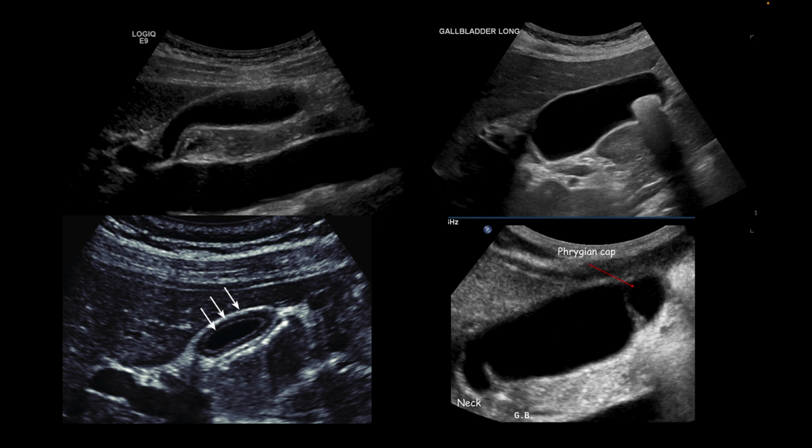Now, gallbladders can come in all different orientations and folding arrangements, and the common one that we see is a thing called a phrygian cap, which is essentially where the fundal part of the gallbladder is folded over on itself, so you get this little bend in the fundal end, and this is a normal variant, though it can look like an internal abnormality to the uninitiated, so just look at it in a couple of different planes and try and build up a mental picture of what it looks like, but that's a phrygian cap right there.